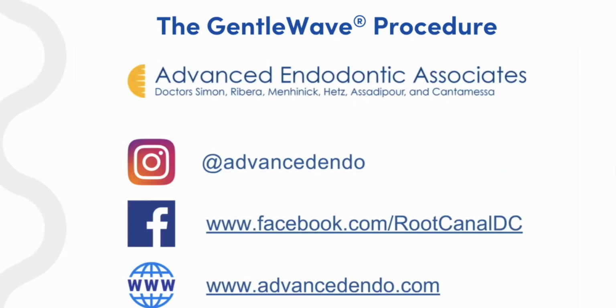Okay, in kind of a related question, but it's the last question we have time for. How does GentleWave affect follow-up visits? Do patients report less pain after they leave your office? How does it compare to pre-GentleWave? We have patients back 3 months, 6 months, a year after for follow-ups. We do this routinely so we can make sure our cases are healing or have healed or are in progress. We do call patients at nighttime, if not the next day. We're given a call list by our staff. You can access the call list on our app from the office. But we do call them up most of the time at nighttime.